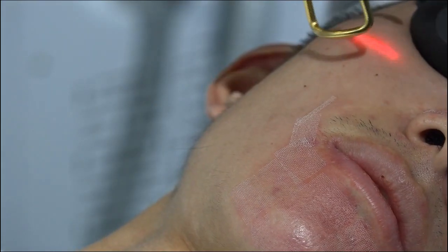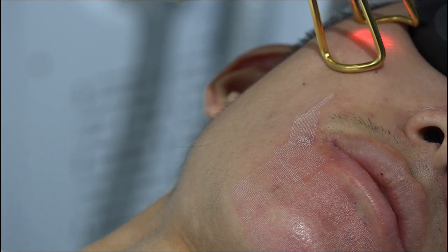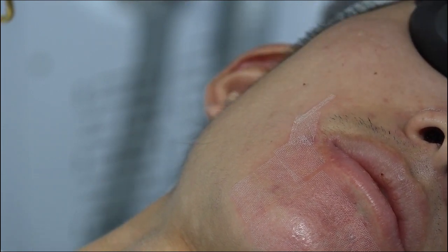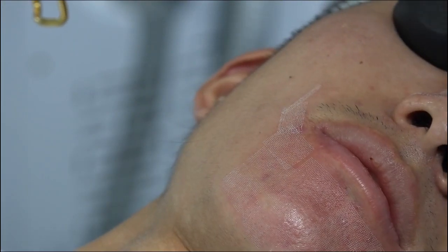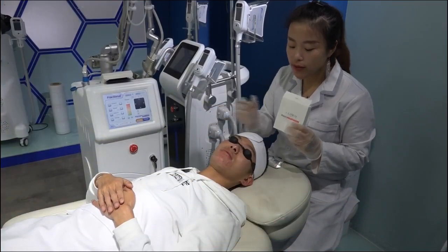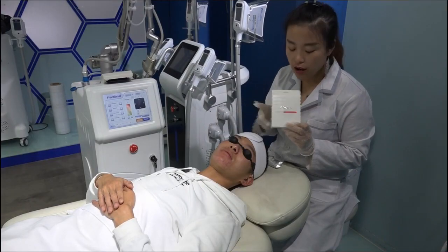Then we do the scar here. Okay. The scar also finished. Okay, after treatments, now we will do the after skincare.